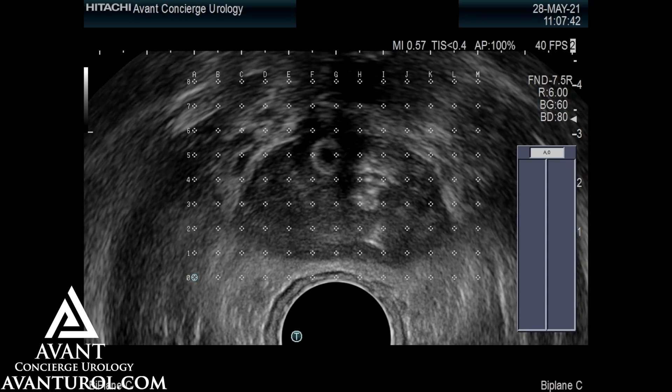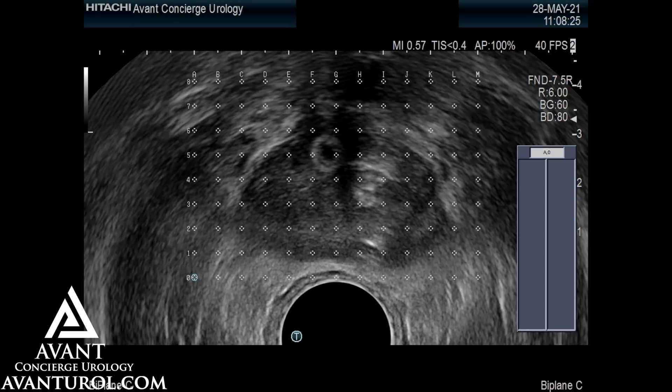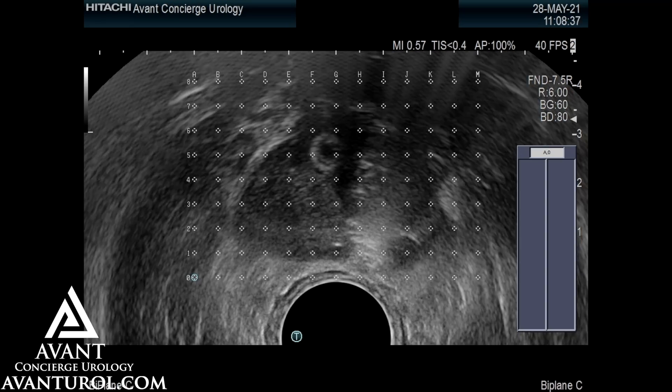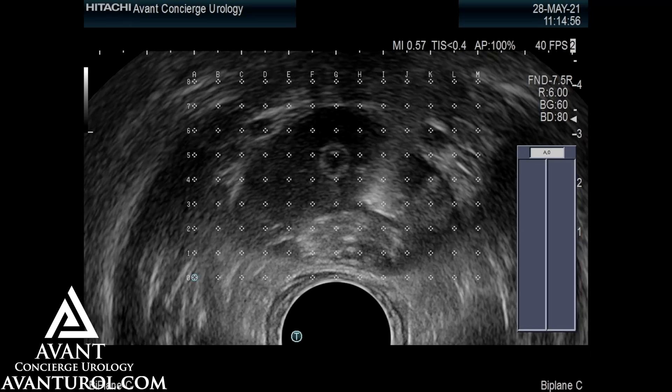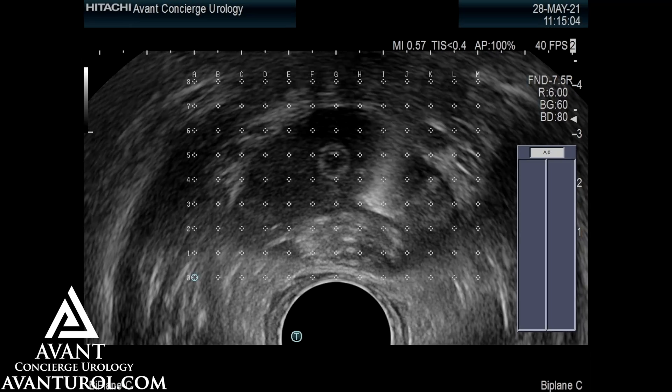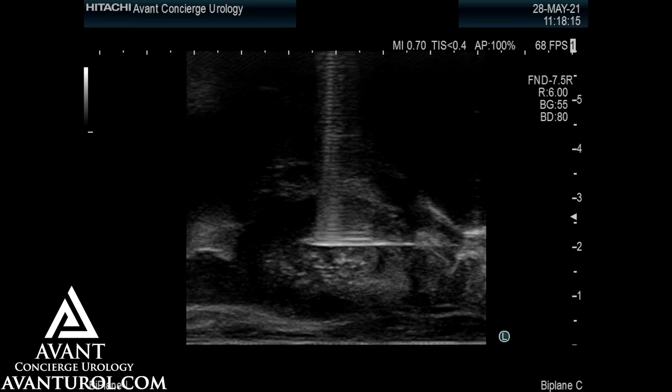In this particular patient, a left hemi ablation of the prostate was being performed. This image shows active ablation using transperineal probes. There is an active electrode and a coiled secondary electrode that prevents the dispersion of energy to the urethra and the lateral borders.